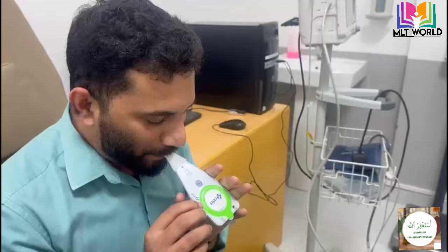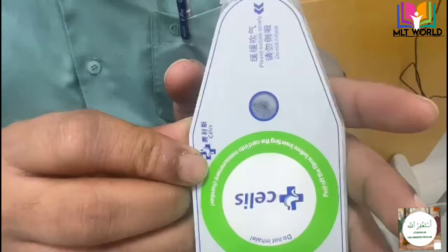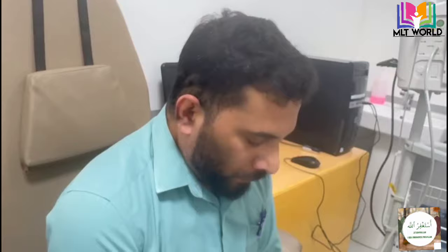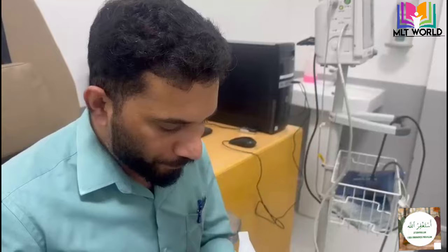The most important thing to notice is that when the patient exhales air into the card, after that keep the card down. Now you can see the color is changing — before it was fully dark blue and now it is changing to white. The card doesn't necessarily need to be completely white; if the patient has exhaled for at least 5 minutes it is enough. I told the patient just 1-2 more breaths will be sufficient.